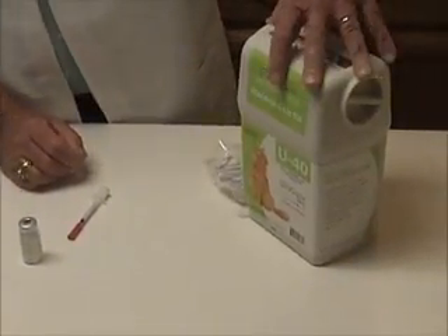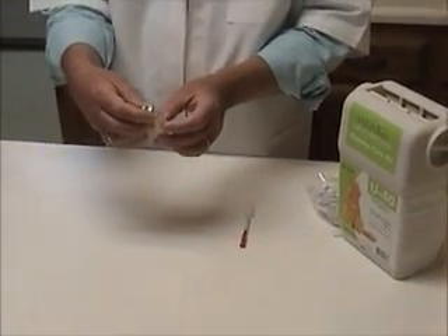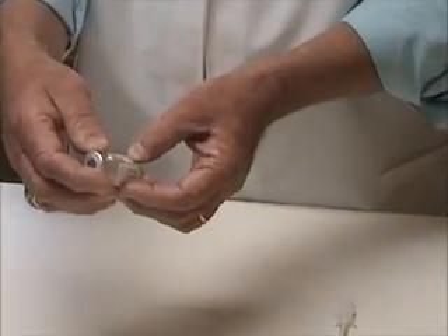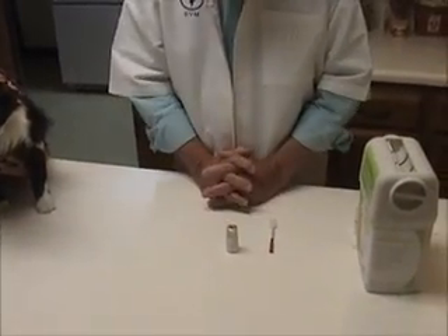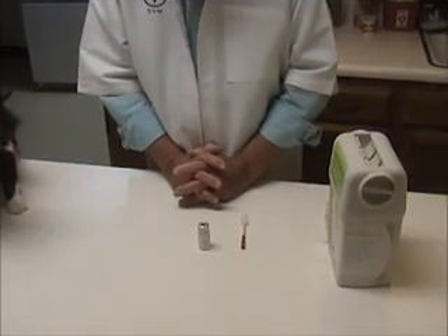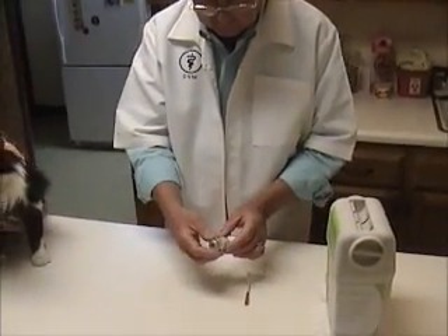The syringes, in most cases, will come pre-packaged. The concentration or the strength of the insulin for cats and dogs is generally 40 units per milliliter, which matches up with these syringes. There are many different types of syringes as there are many different types of insulin. We prefer this because it's easier to dose with. Again, the syringe matches the insulin.